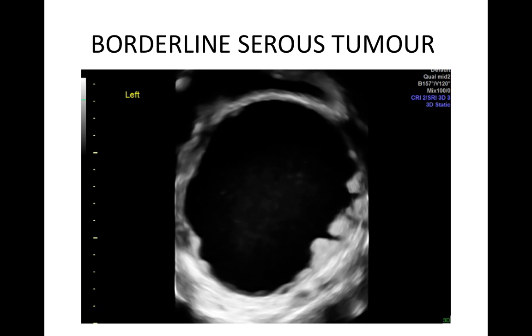Borderline cysts can be unilocular solid or multilocular solid with papillations arising from the capsule. These are especially suspicious if they are numerous and vascular. It is often not possible to distinguish between borderline tumours and early invasive ovarian cancer.